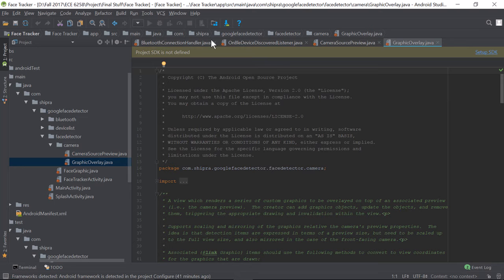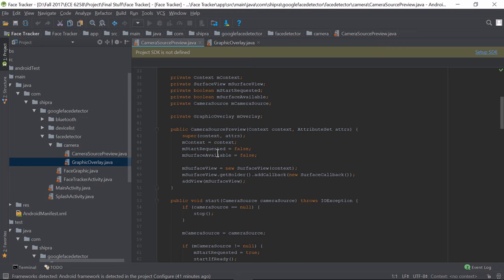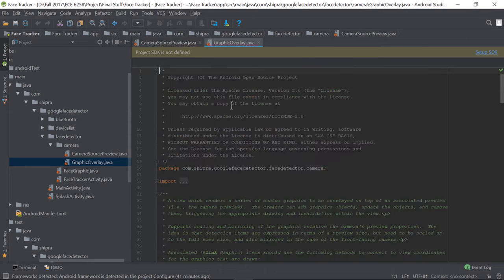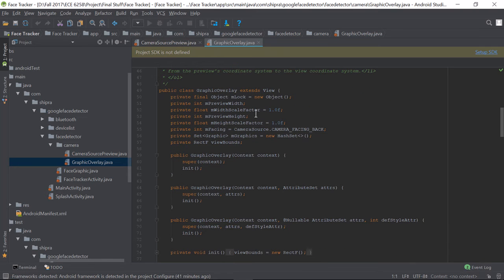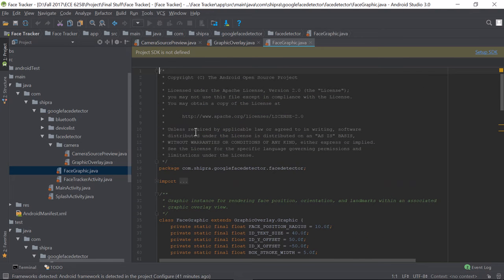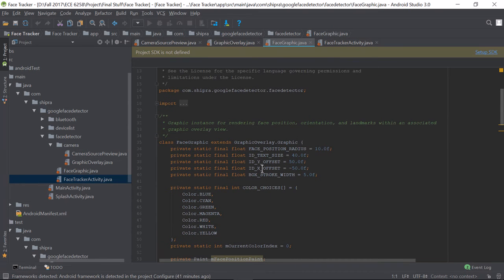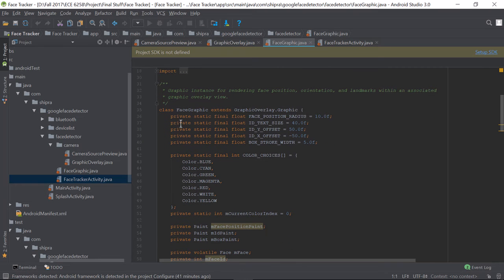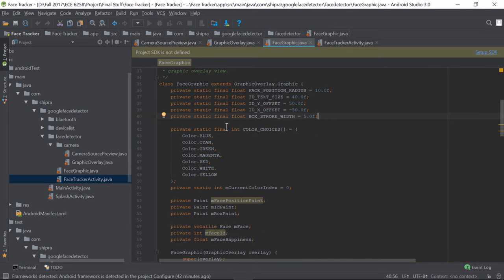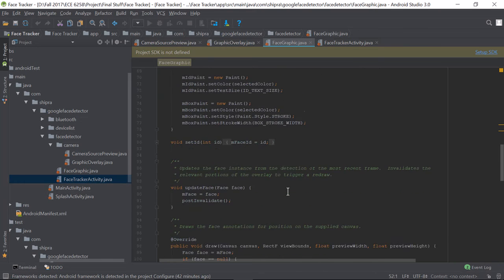Up here what you'll find is camera source preview, setting up the camera. These are the basic Android codes that you need to access your camera and start using it. So we're currently using the face camera, setting the height and the width. So all the basic details regarding how to use the camera. Now the face detector and the face tracker part, these are where the basic part of our code runs. The application basically is mounted here. These are the basic definitions for how thick we want the box to be, their coordinate system, their face detection, how they're using it, and what kind of colors that we need. Setting up all those colors and the paint.